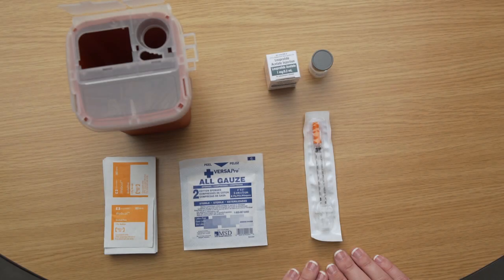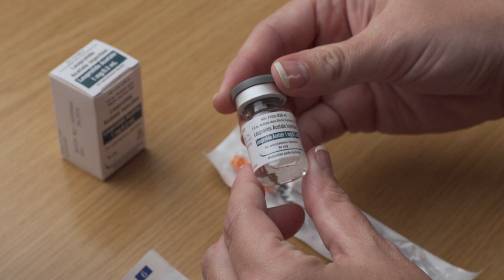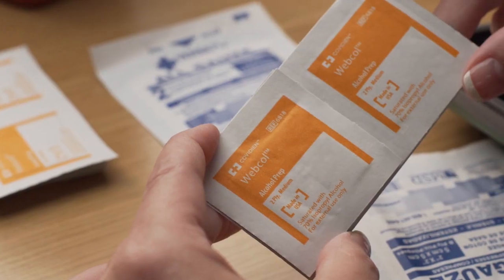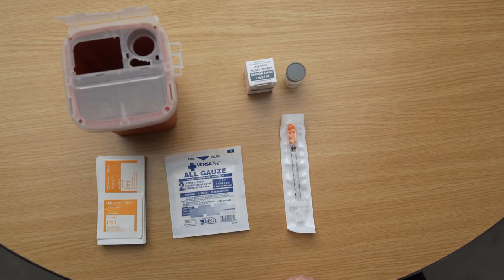Before you begin, be sure to have all of the following items: one vial of Lupron, which may be labeled as Leuprolide Acetate. If a trigger kit was ordered, it will contain more Lupron than you need to administer. One syringe marked in units, alcohol swabs, sterile gauze, and a safety container.